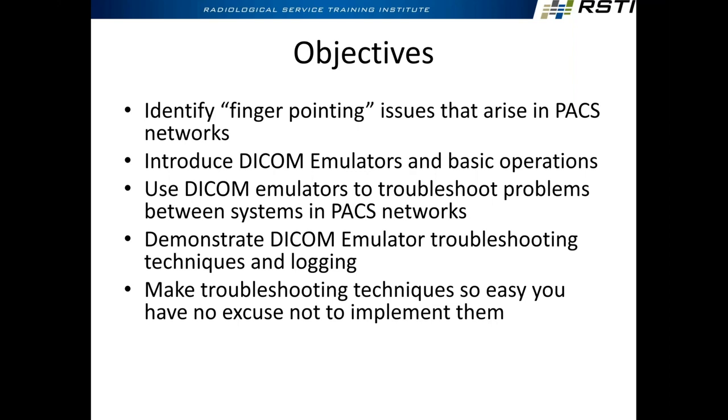And this is really the key here: logging, because now we have proof that whatever's going on is going on. So instead of going to IT and saying, I think this or I think that, no, here's what's going on. Here's why. PACS is doing this, and the modality is doing this. Here's exactly what's happening on the network, with no refuting it.